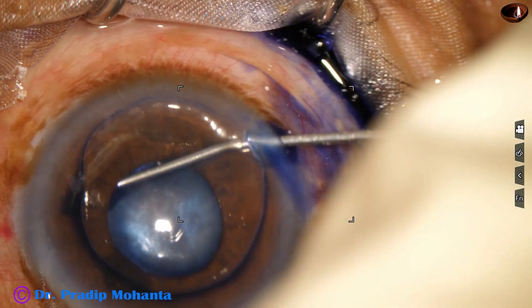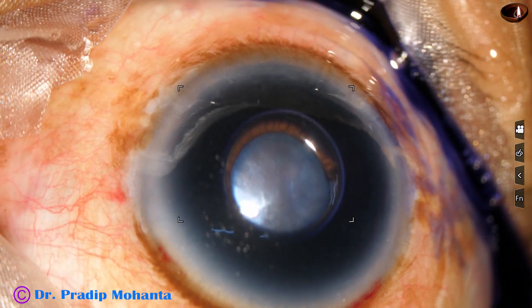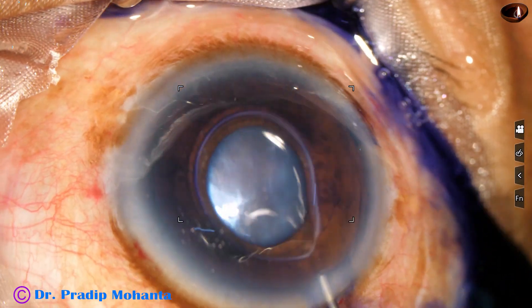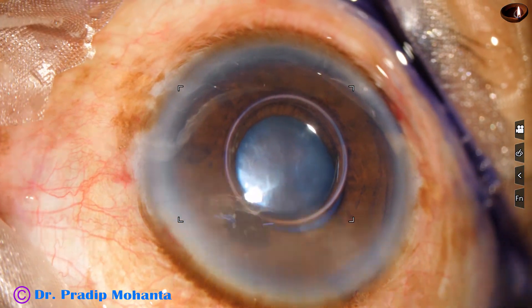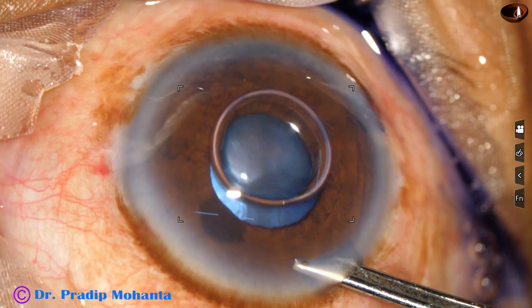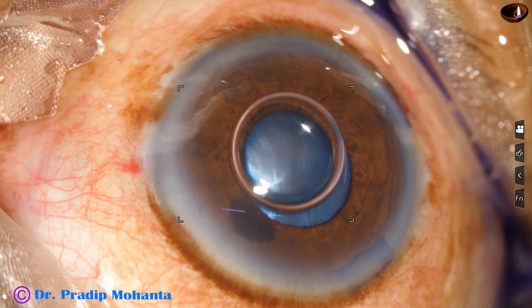All the incisions have been made. The anterior capsule is being stained with trypan blue dye, and then we are administering two agents — Adrenaline and Phenylephrine. We see that the pupil has not dilated at all.